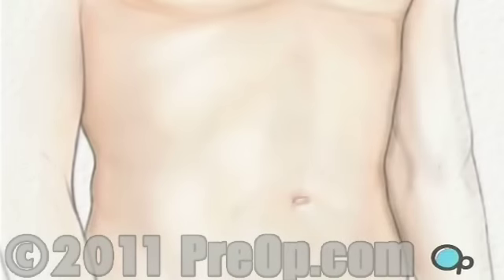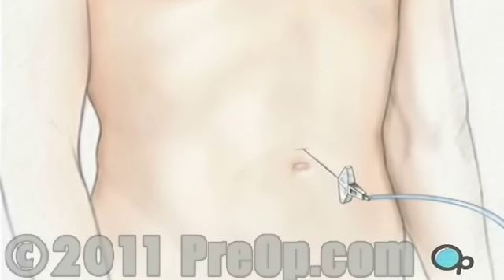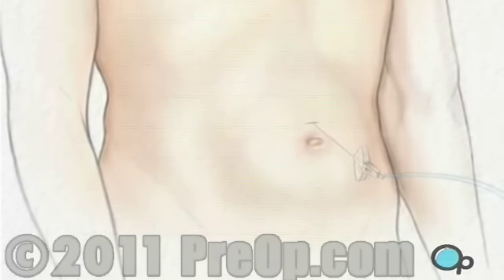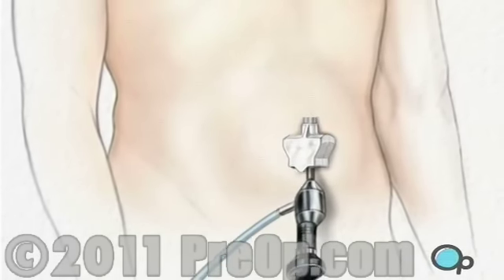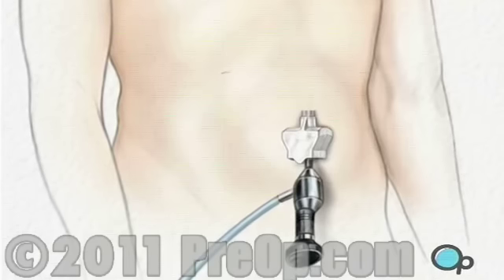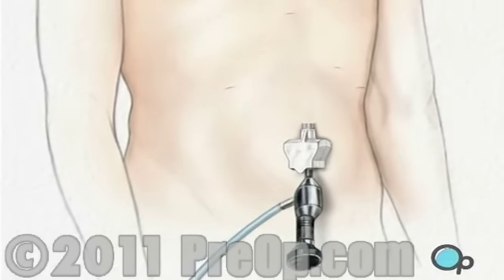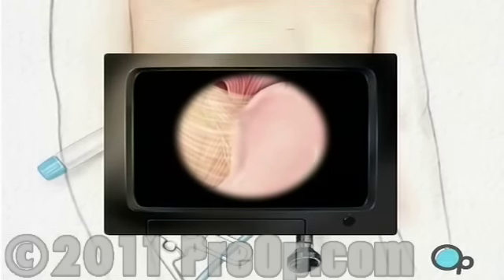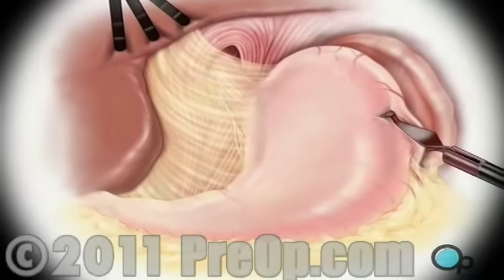After allowing a few minutes for the anesthetic to take effect, a small incision is made above the umbilicus. Then a hollow needle will be inserted through the abdominal wall, and the abdomen will be inflated with carbon dioxide. An umbilical port is created for the laparoscope. 4 more incisions will be made, with care taken to keep the openings as small as possible. Once in place, the laparoscope will provide video images, so the surgeon can insert the instruments used to locate and pull back the liver in order to see the upper part of the stomach.